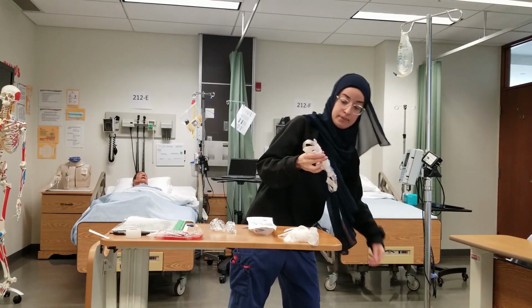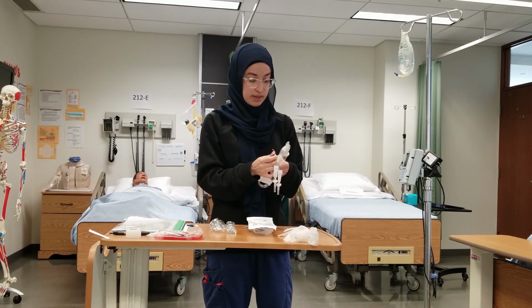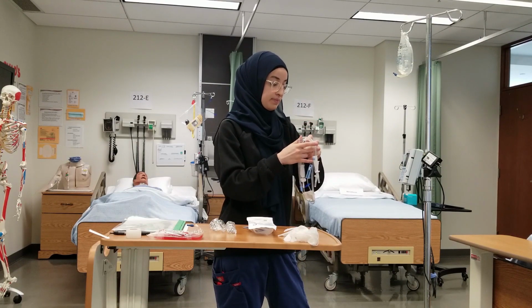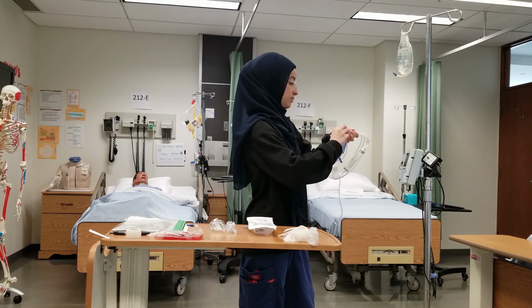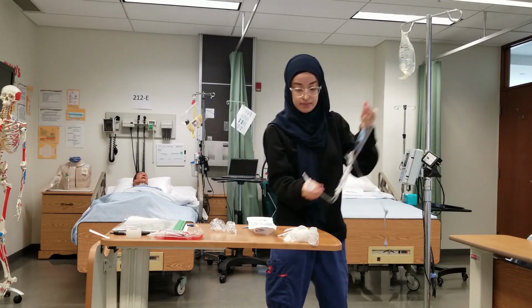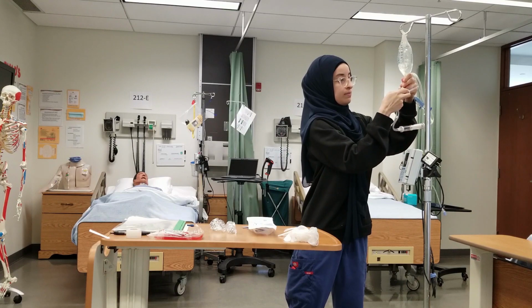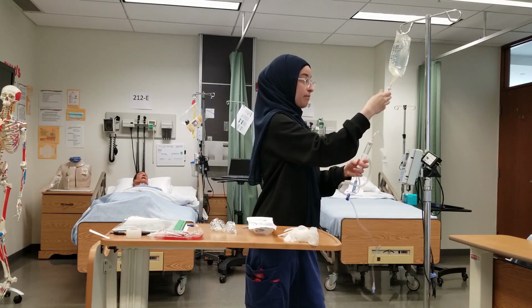I've got my Y tubing. I'm going to close all my clamps so that when I spike, I don't spill. And we're only going to spike one side with the normal saline for now. So I've pushed my clamps up. And then I'm going to prime my line.